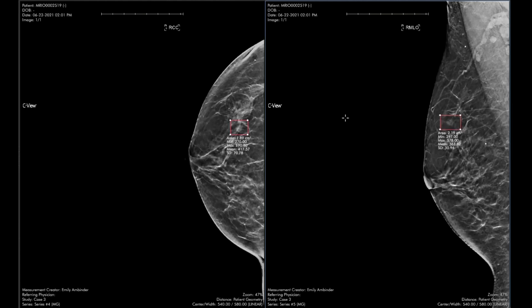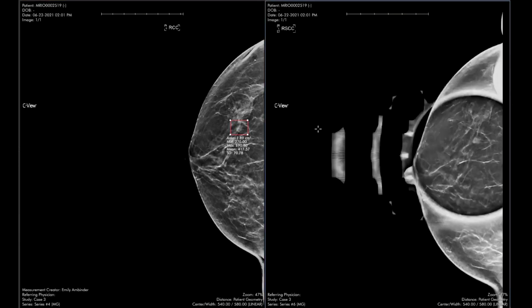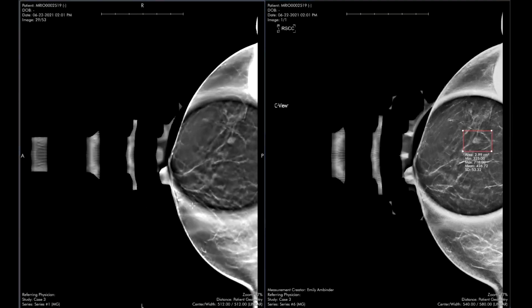When the patient comes back for additional imaging, we start with spot compression views to better evaluate that finding. So here's the CC spot view. This is the C view. And again, we see this finding. It's in the upper breast. And let me just show you the tomo here. We see this is on the CC view, but it looks like a circumscribed mass. It's a single mass. She doesn't have multiple masses in both breasts.